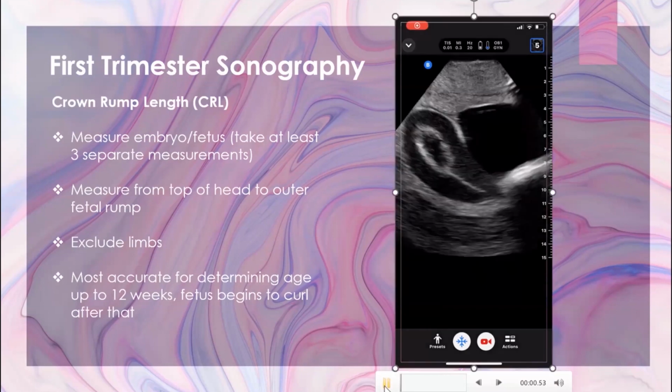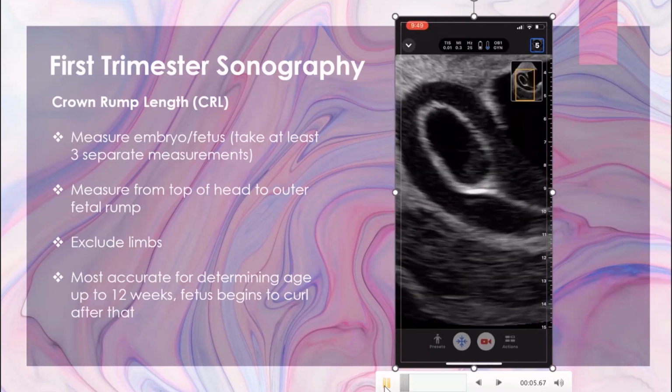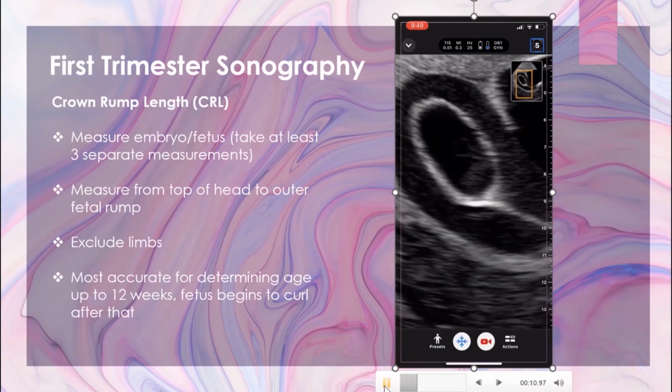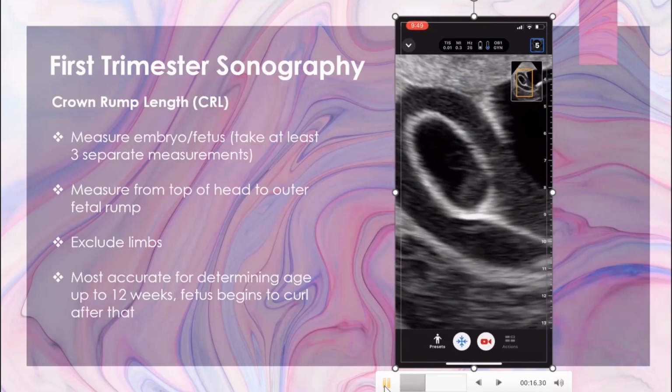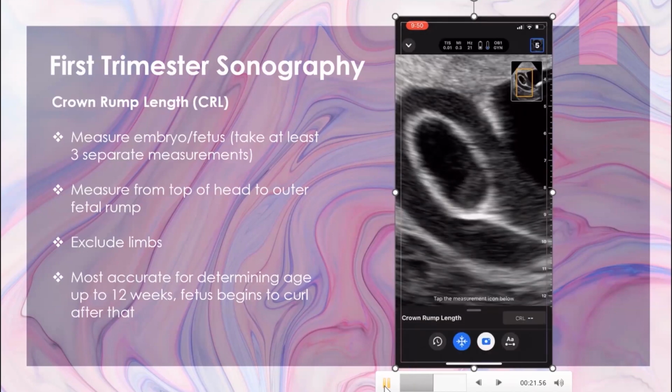So let me go ahead and play this video. One thing of note is you can see I'm looking for the fetal tissue, looking for the best image, and then I zoom in on it because I really want to get these calipers right, and I'm not liking my image. So I zoom back out, and then I increase the overall gain to make the fetal tissue stand out better, to get that measurement. So then I selected the crown rump length measurement so that it will be put into my package and give me a gestational age. And then now I'm just trying to get my calipers to work with me to get a good CRL measurement.